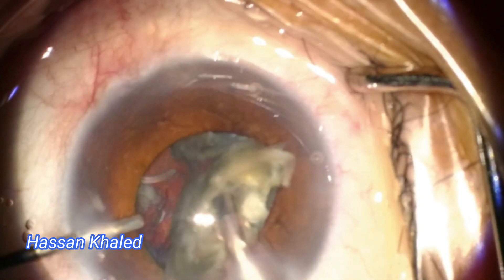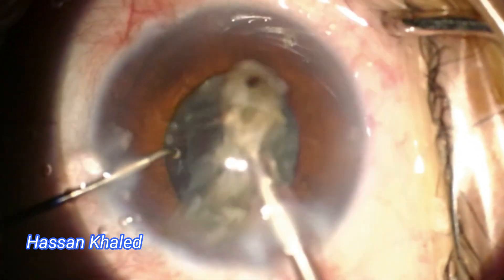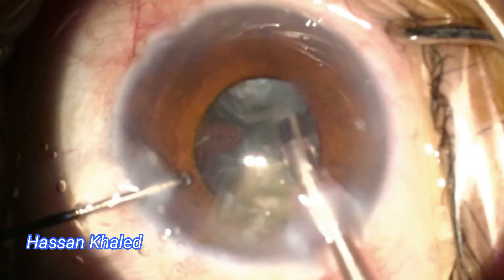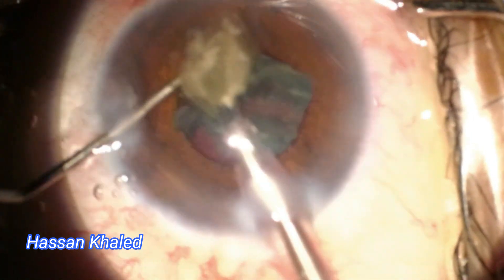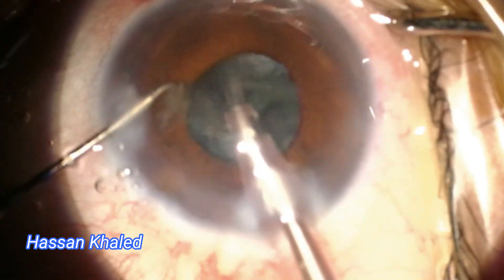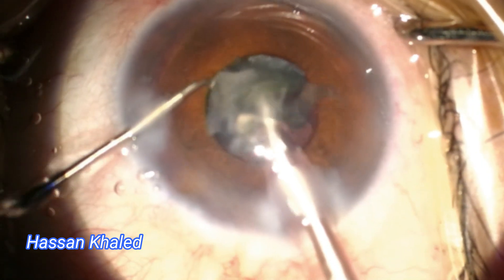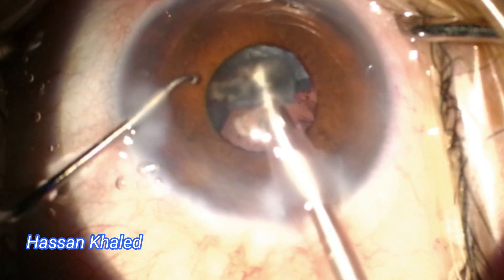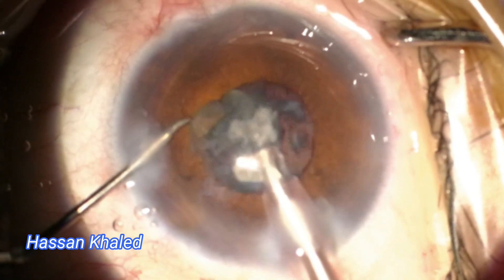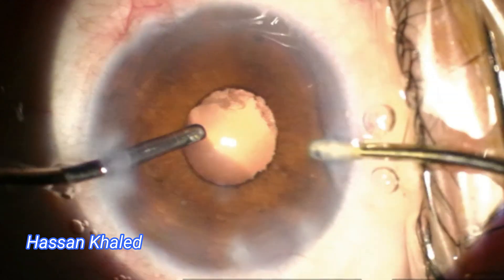Now, here is the last and the end of emulsification of this dense nucleus — here's the last fragment. Everything is good, but look at the pupil, it's narrow now. Just aspiration of the cortical and epinuclear fragment by the end of emulsification. Then taking the phaco probe out of the chamber while keeping the anterior chamber stable.